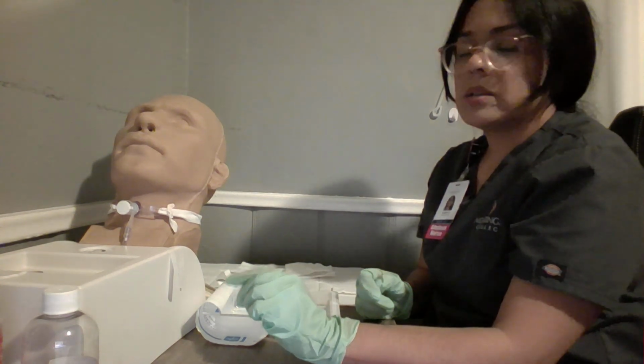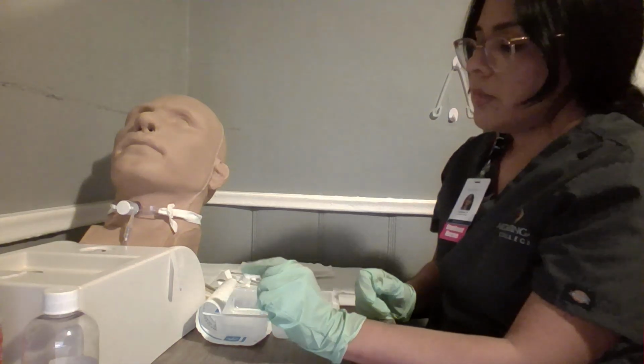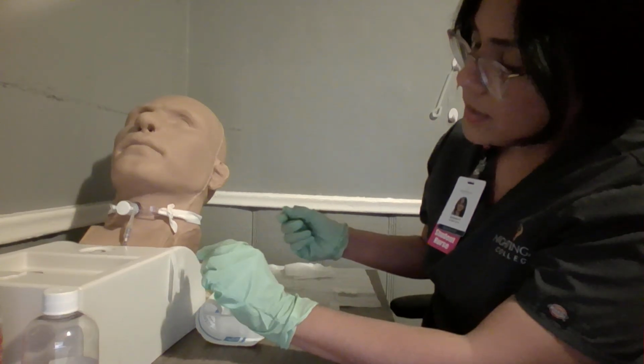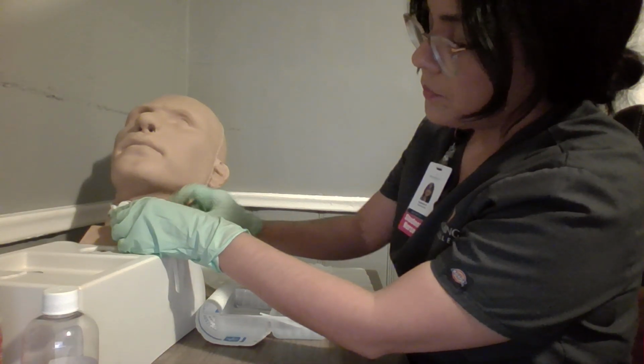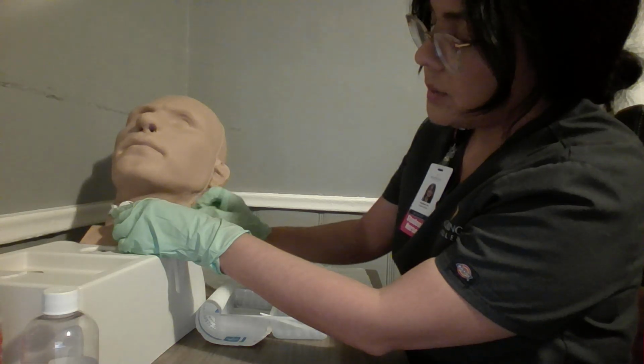I will take this opportunity to inspect the area. I want to make sure there are no signs of infection or skin breakdown. I will replace the ties now. And I want to make sure that I'm stabilizing the cannula here as I'm doing that. So I will change the tracheostomy ties.